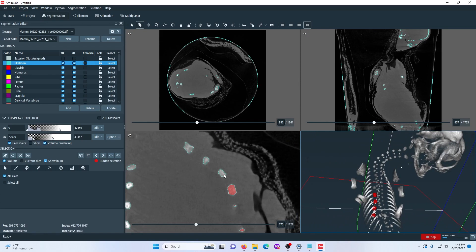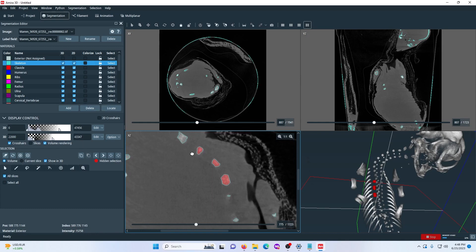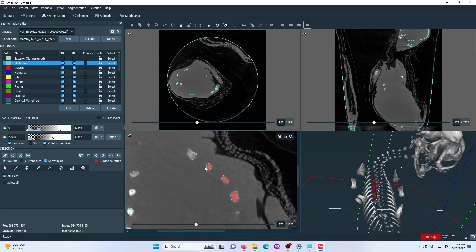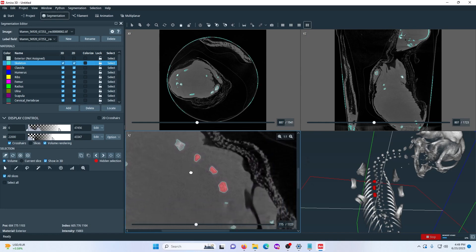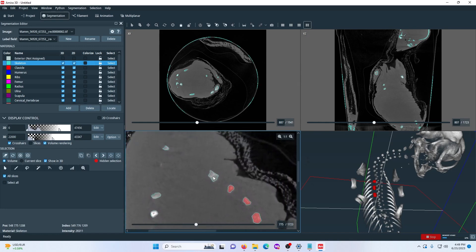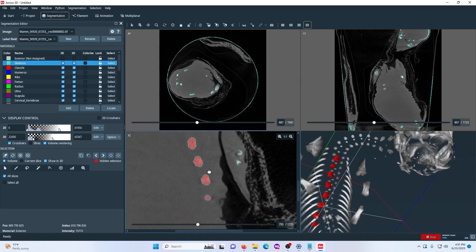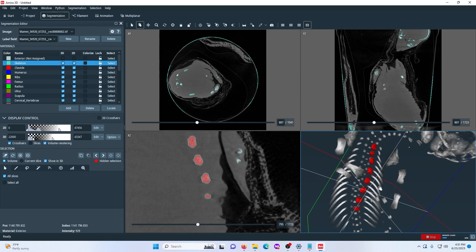So I just selected this bone at random and this looks to be the sternum. It's the bone in front of your organs that the ribs connect to. So I'm going to select the full row of these. You can see that this is the green plane, so I'm looking at it splitting it down the middle like this. Hence why I'm getting all the sternum in one line, which is really nice. When you're selecting stuff with the mouse tool, if you just click on it, it'll deselect everything else. If you hold down shift and click, it'll select it in addition to your last selection. If you hold down control and click something, it'll deselect it. So it'll take it out of your selection. So I like to select everything that's in the same material at once. And in order to move my mouse around, I have to press the scroll wheel button. So don't click out here or else it'll select everything in the entire CT scan. It'll take like minutes sometimes and then it's not good for anything. Sometimes it crashes the program. Make sure when you're touching here outside of the borders, you want to press the middle wheel and use that to move around.